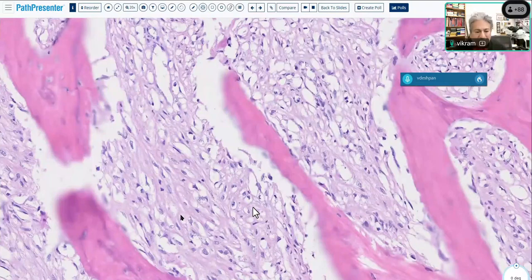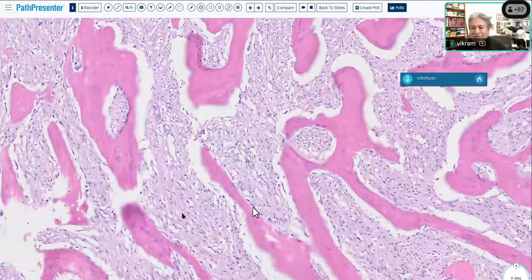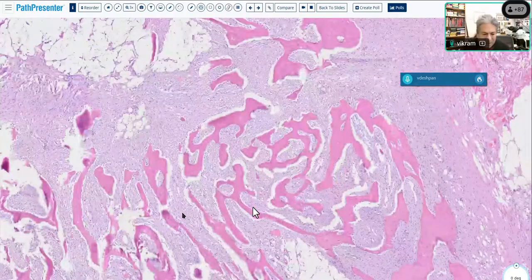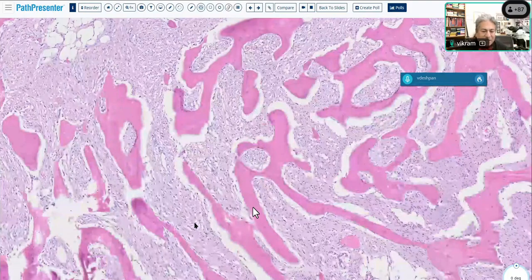And by atypical, I mean the cells are larger and more hyperchromatic. Although if you're a beginner, you don't have a reference in terms of what is benign and what is malignant. I remember when I was training very early on, people would say, oh, this is atypical, this is malignant, and they wouldn't give me a detailed explanation as to precisely what is atypical, right? So I was trying to do a little bit of that. But it is hard.